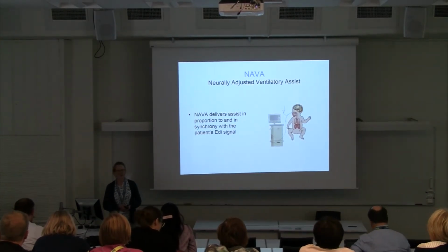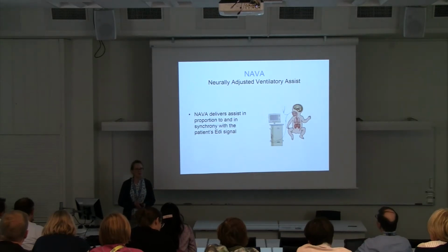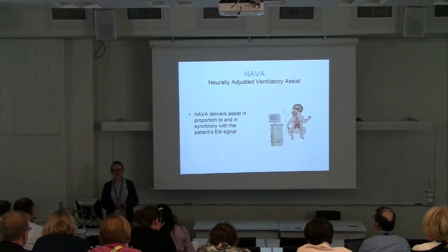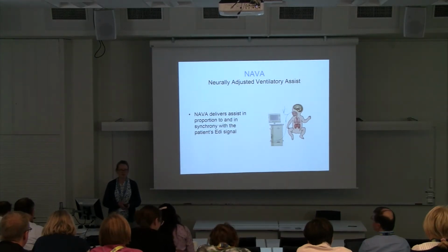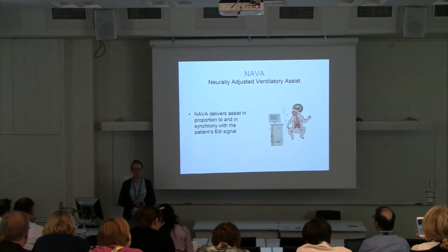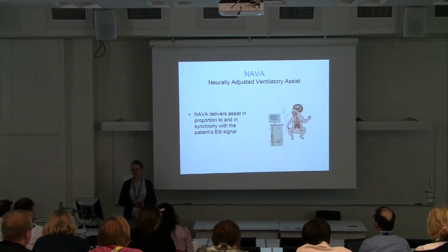NAVA stands for Neurally Adjusted Ventilatory Assist. To make it short, it means that NAVA delivers assist in proportion to and in synchrony with the patient's own EDI signal.